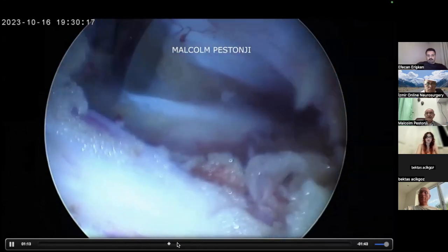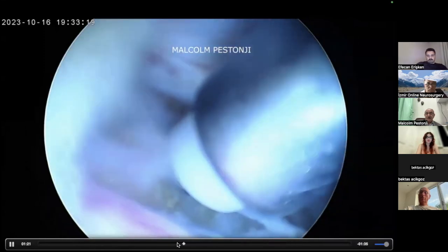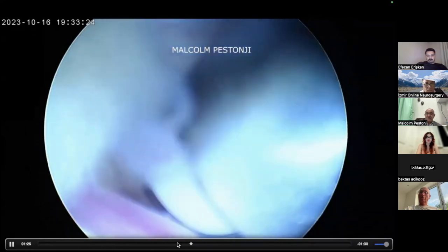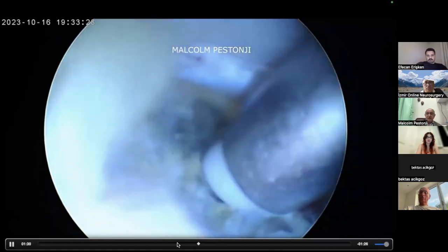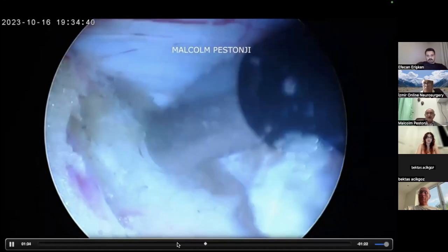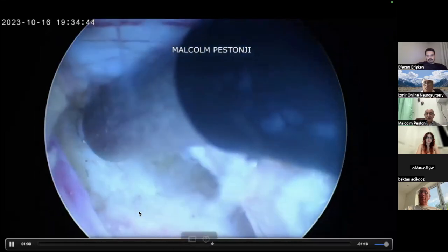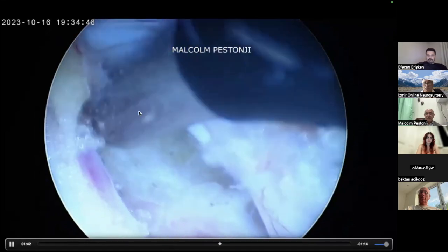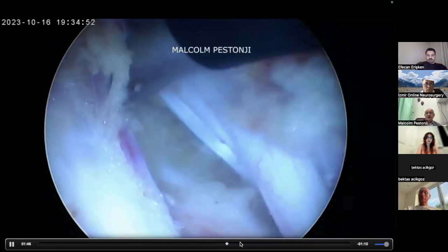See how this PLL has thickened. And see how I have to cut it. It takes time to cut it. Slowly, slowly I cut through it using a plasma right in the axilla. And then finally the discal surface and the bone surface and everything becomes clear. Now there is no vascular pathology there. There is still some underneath the root here. But the major part of this band which was troubling, elevating this root, causing crush on the root is gone.